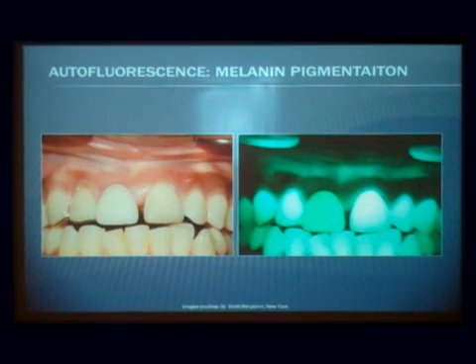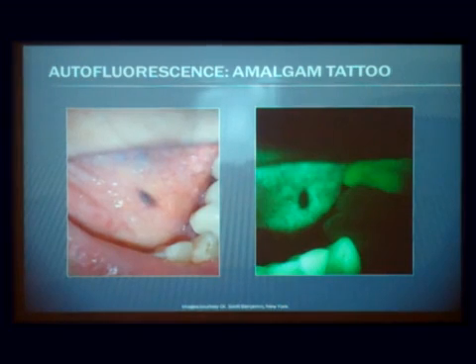We've got inflamed salivary glands. They follow the pattern of inflamed salivary glands, so this is not something I would think of as suspicious. And certainly if you have melanin, it does the same as hemoglobin. It just soaks up the rays, and you get dark areas wherever there is melanin deposition. And amalgam will do the same thing. I don't know how that works, but it does.